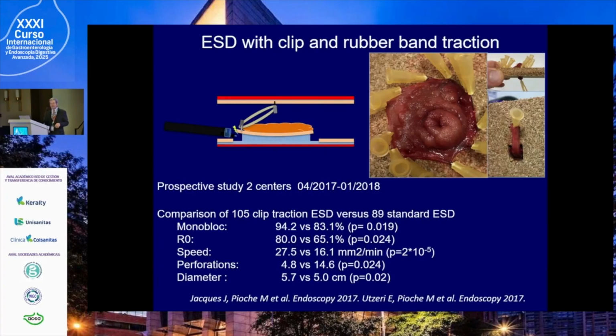So I prefer to recommend clip rubber band traction, yes, and ESD. We have done this in France for more or less 8 years now, okay? And we have better R0, better monoblock. We go faster, with less perforation, using traction for the appendix. I will show you.